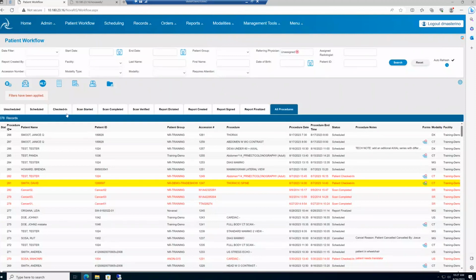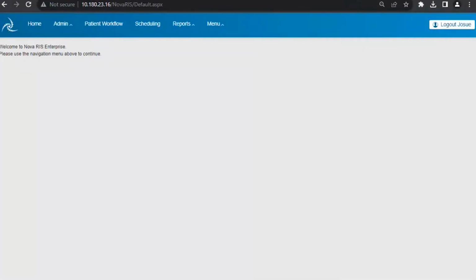And they are, just because uncluttering screens for other users is a really helpful thing, especially whenever I was dealing with many techs that were outside of our facility. So with that, I will send things back to Josue to pick up on some others.